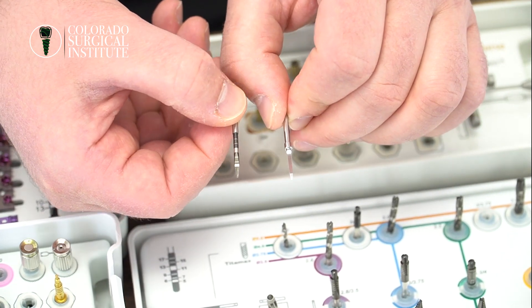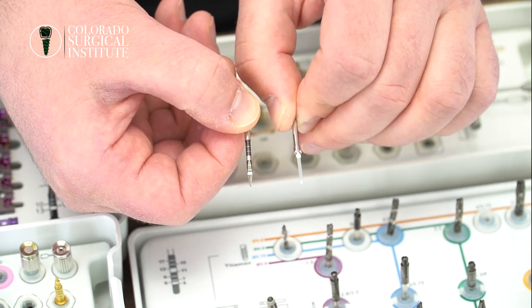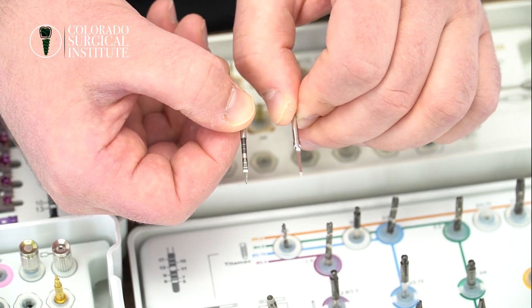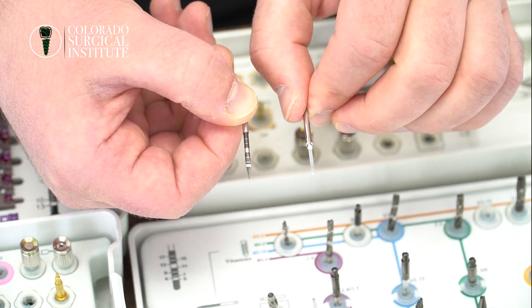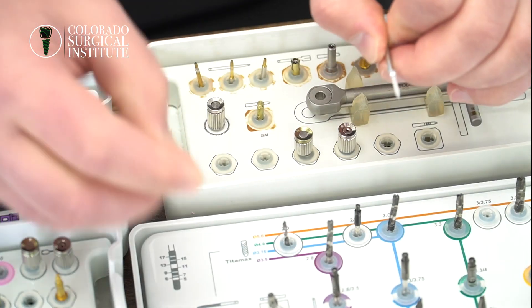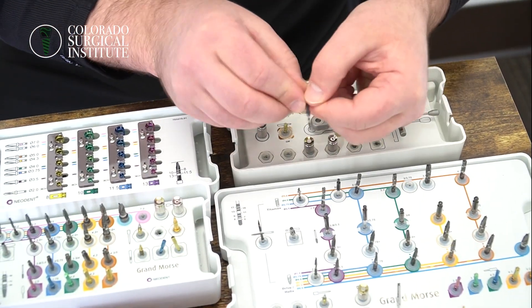In starting your osteotomy, especially in the beginning, it's all about being very, very precise in terms of where we're putting it. When we look at the following videos it'll start to make sense why we're using a smaller, sharper burr in the beginning — because you have more room to change your angulation, more room to change the width, pretty much everything together. The other burr that I like to use sometimes is a Lindemann burr.